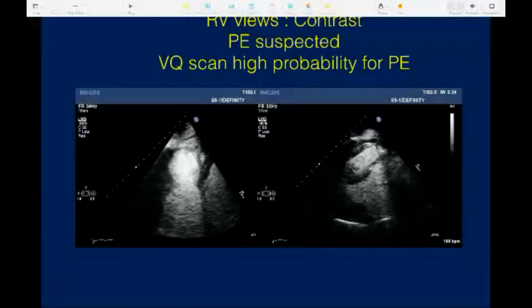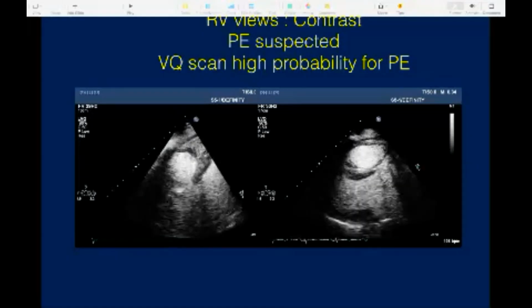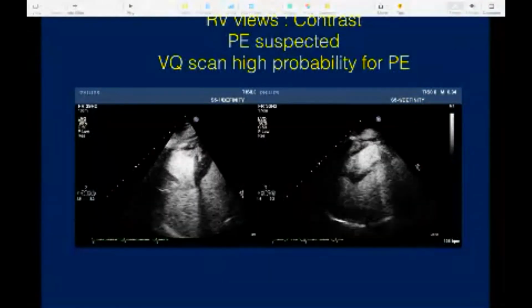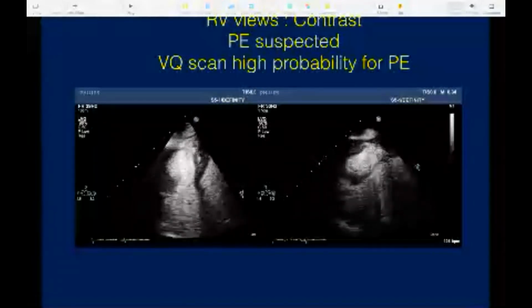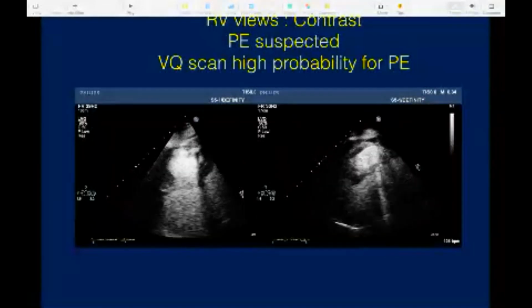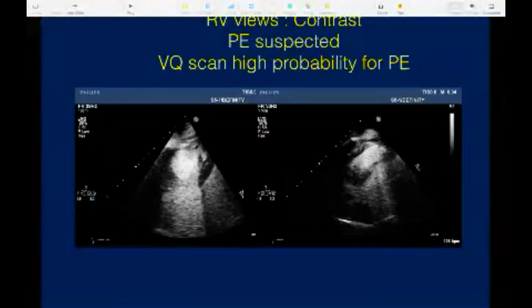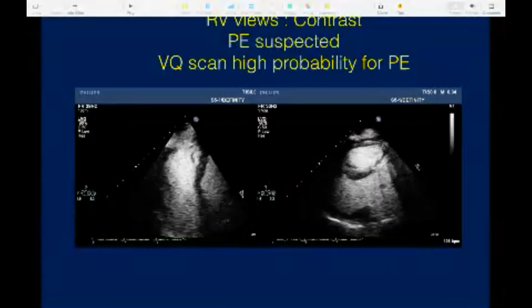And that's why MUGA has always been at the top. But with the advent of contrast echo and strain imaging, I think the attention to echocardiography has shifted back. But with that comes responsibility, which means that in the labs, when we use contrast, we have to do internal quality control to ensure that our inter-observer and intra-observer variability is within acceptable range. Because if we say the ejection fraction is 55% one time and the next time 63%, what do they do with chemotherapy at that time?